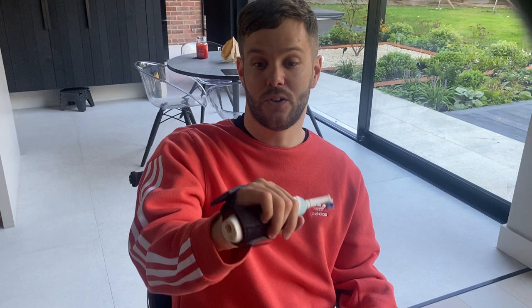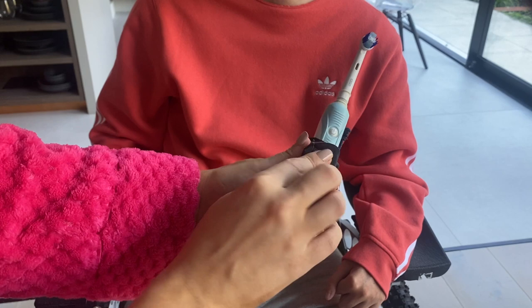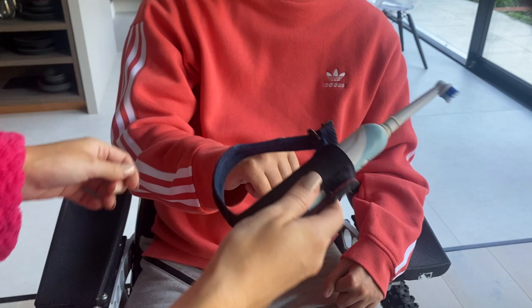This is how I brush my teeth. I need someone to give me a hand to put the toothbrush into the strap and onto my hand, put some toothpaste on the end and press go. But once that's done I can do it myself. Ideally I wouldn't need help turning it on, but the strap gets in the way, and if you put the toothpaste on and then turn it on, the toothpaste is going to go absolutely everywhere before it's in my mouth. So I do need help putting it on, but once it's all set up, easy.